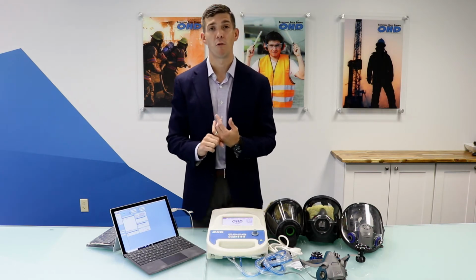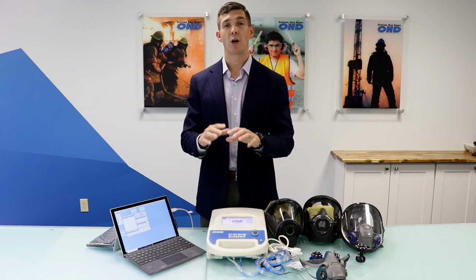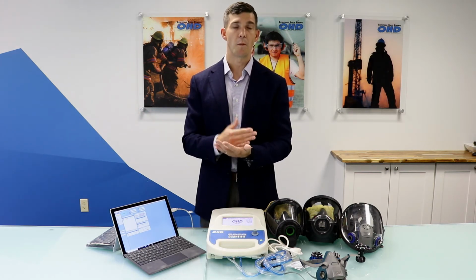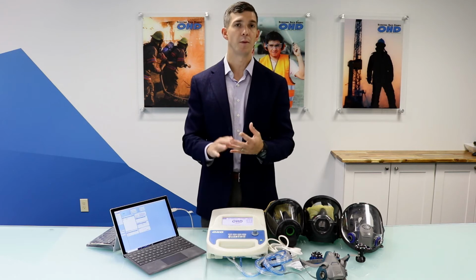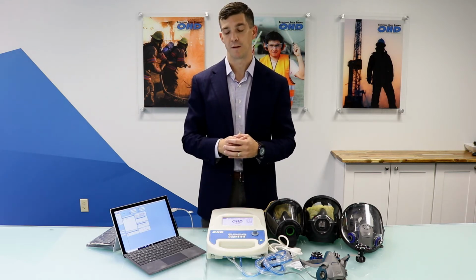Once you load the software and launch it the first time, it will require you to add a company. So you'll want to go in and add a company. If you're doing fit testing on multiple companies, don't worry about that. Add the original company and you can always add more companies later. But if you're only doing fit testing for your department, your company, whatever, you can add in that company and then assign people in for fit testing.